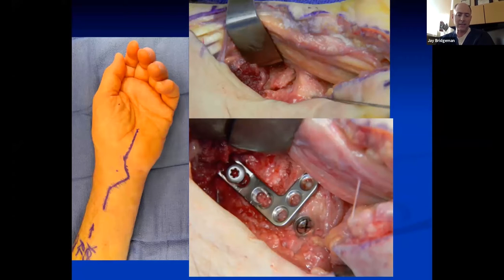You're going to identify the FCU. Deep to the FCU, you identify the ulnar artery and nerves and retract those safely. All the flexor tendons can then be retracted radially. Right at the base where you'll be working is the pronator quadratus, which you have to elevate. Once you've done that through the extended carpal tunnel release, you should have wide exposure of that volar ulnar corner, which is necessary for implant placement.